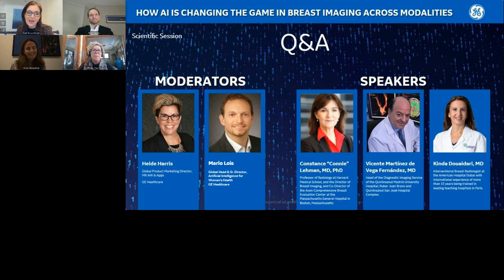Dr. Lehman? I agree with you, and I really like how you present that this is a transition. It's not a light switch where we have reading rooms filled with radiologists reading mammograms, and months later they're all moved out and we replace them with robots. It is a continued process. We have practices where they are double reading, with 2 humans looking at every mammogram. That makes sense as a first phase. How would it compare to have 2 humans versus an AI program targeted for that specific use case and 1 human?